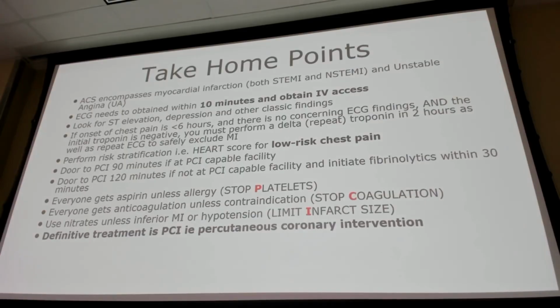There's a lot of different terminology. They wanted to try to change it to occlusive myocardial infarction. But what we're trying to figure out is whether it's a STEMI versus an NSTEMI versus unstable angina. Anybody who presents with chest pain, we have to get an EKG within 10 minutes. Then we set up our safety net: IV access, put them on the monitor, oxygen if we need it. Then we evaluate that EKG and decide whether there's ST elevation, depression, or ischemia.